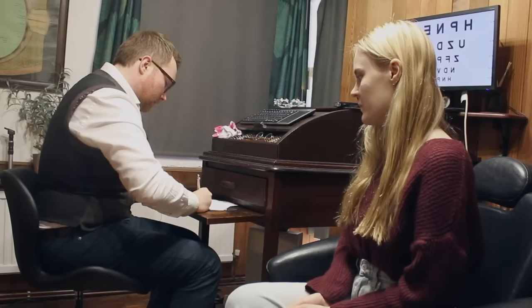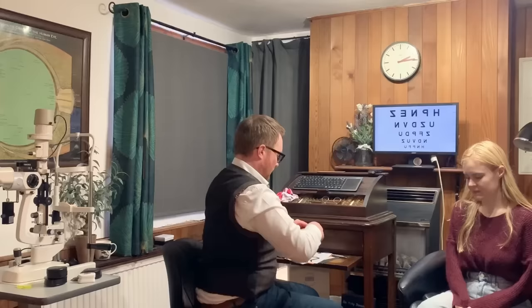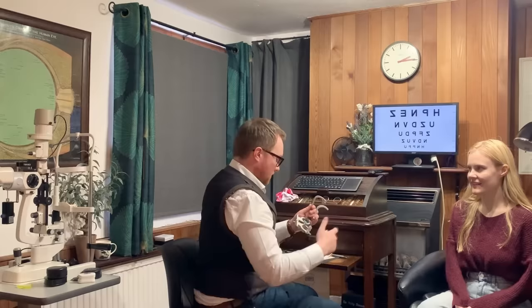Brilliant. Right. So what we're going to do now is have a look at your prescription and we'll have a look at sort of what we're finding today, and then I can give you an idea if it's changed at all. So we've got some very stylish glasses to wear. So we'll have a look at your glasses prescription and then we'll have a look at your eye health. So we've got the camera and the scanning laser ophthalmoscope, and then we'll be having a look on the microscope as well. So sort of the full MOT today.